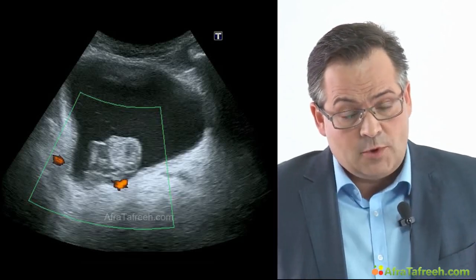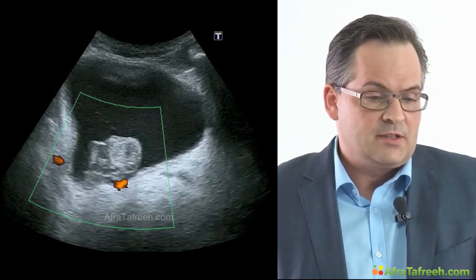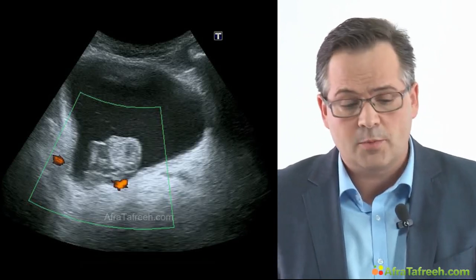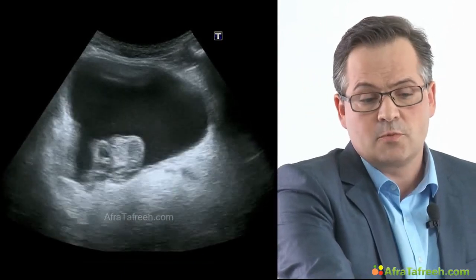So, what could it be? Either a tumor or clotted blood, or maybe a stone. So I tried to find vascularization. I used the color Doppler and was looking for some vessels. I couldn't find them, so no vascularization could be seen. There was no acoustic shadowing behind this structure, so... It was no stone? No stone.